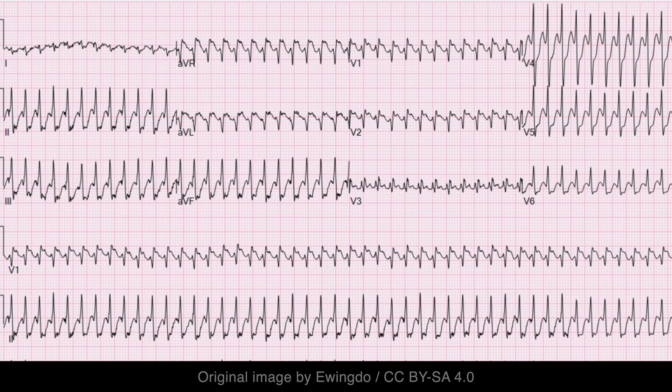Here we have a case of atrial flutter with 1:1 AV conduction. Not only is the ventricular rate extremely rapid, but the F waves are distorted by the QRS complexes.